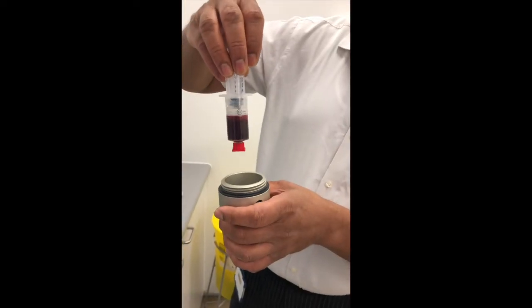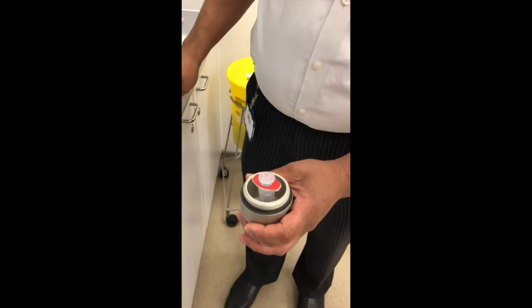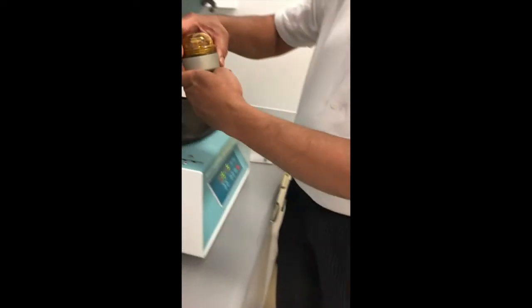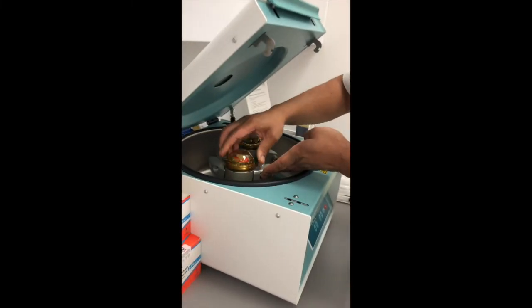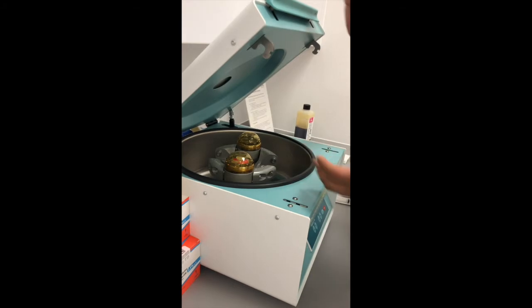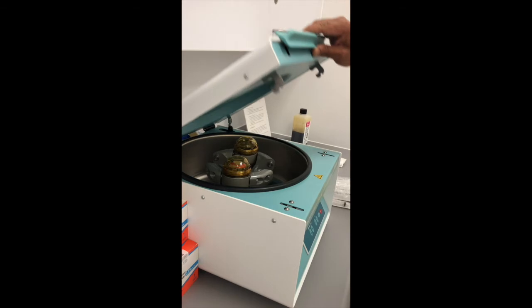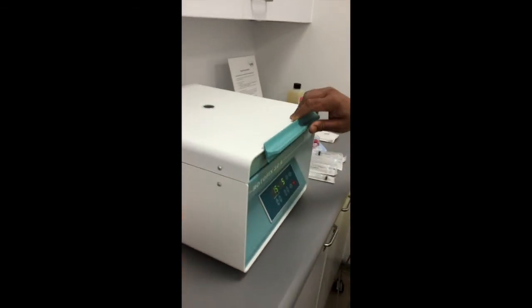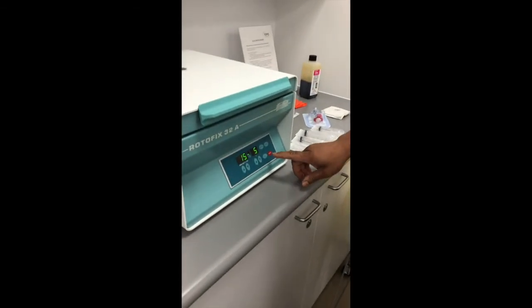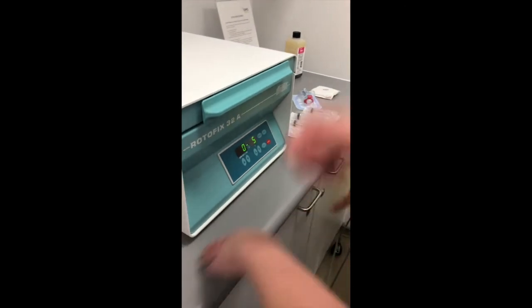The syringe is now capped off and placed in the centrifuge machine, which has a tube on one side and a balancing tube on the other. You can put up to four samples in one go. If you're only doing one patient, it's important to balance the machine; otherwise the tube could go flying inside.